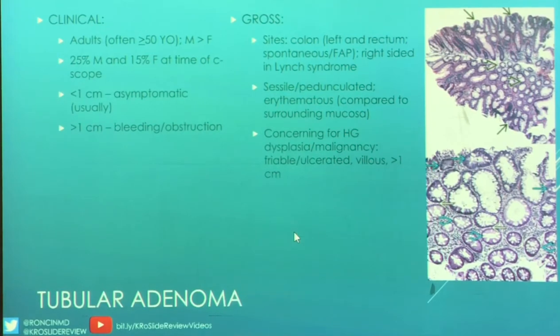So on the top, what you can appreciate is that they are extremely blue compared to the surrounding mucosa. On the bottom, towards the top of the bottom picture, you can see they're extremely blue, almost like they were at the base of the crypts, but they're at the surface, so it's like this reverse maturation or loss of maturation. And then what else do they have? There's some inflammation, looks like some Paneth cell change. Anyway, we're moving on.